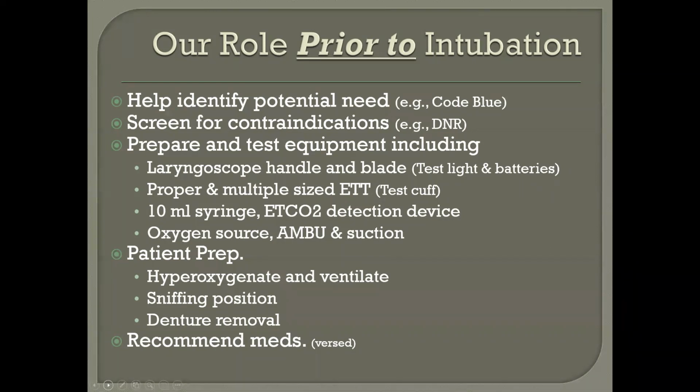If you do end up using an LMA, and I know this is intubation, it's not putting in an LMA, keep in mind that LMAs have about 3 to 4 times the volume.